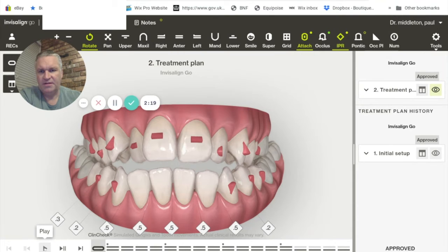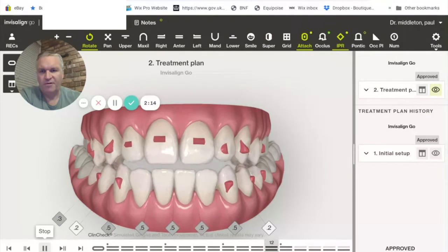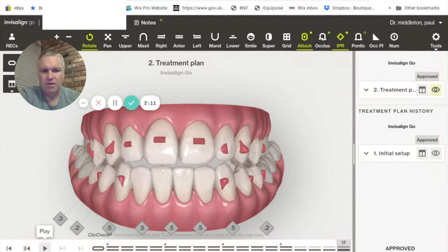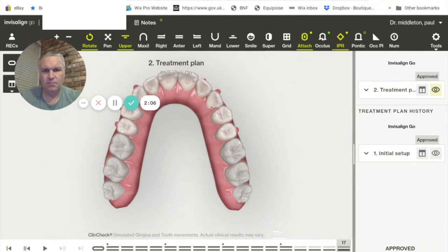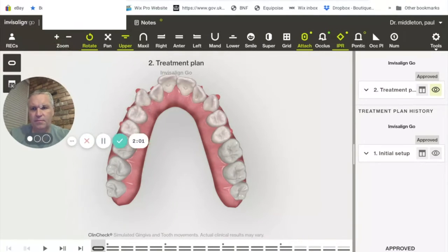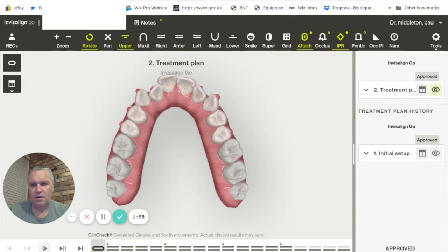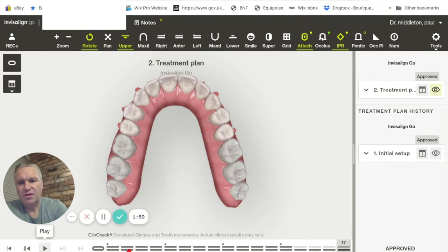Now, if I press play on this one here, obviously it's a little bit more of a dramatic difference because it is a more complex case. I can also show you from there. Let's take it back to the beginning. And you can see the teeth gradually, aligner by aligner, moving into the desired position. These numbers at the bottom here indicate the aligners. So we're going from 0 here up to, this is now aligner number 17.